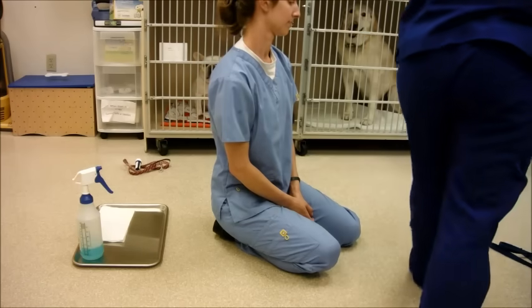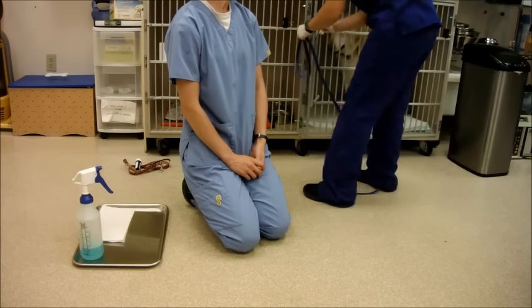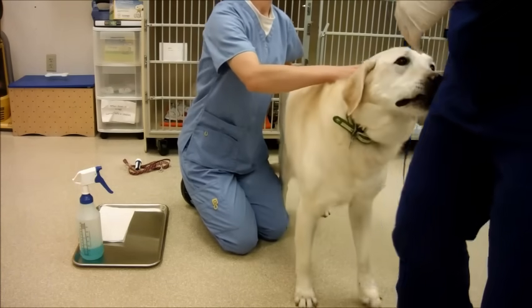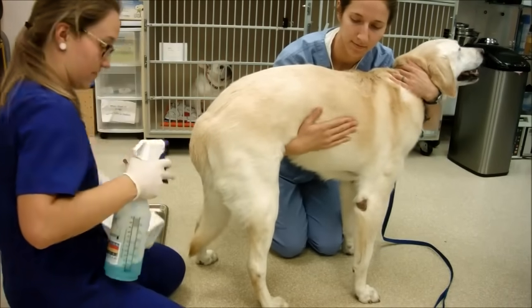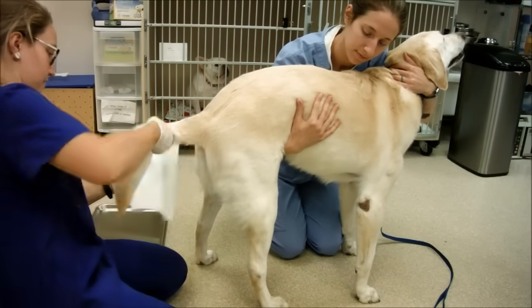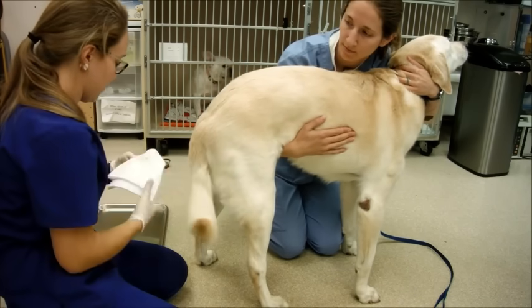Say that he had evacuated — just so you know, I have one of those pee pads in the cage to collect anything he would have evacuated. I'll let him come back out with the lead. I have Dr. Kate apply restraint for me again. Then I would use this waterless shampoo — I'm actually going to use it because it's not going to hurt him. I'll put it on a paper towel and just clean up the area, making sure any debris he would have gotten on him is cleaned off really well.